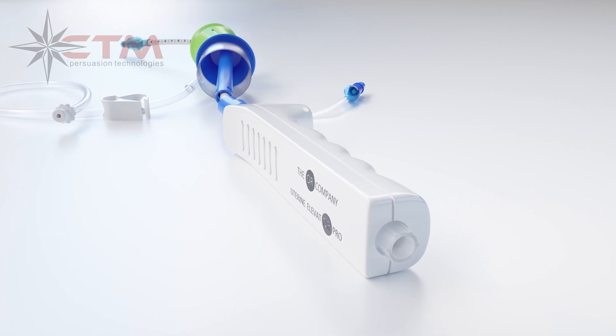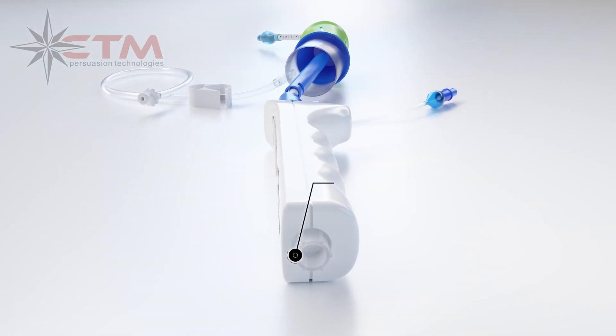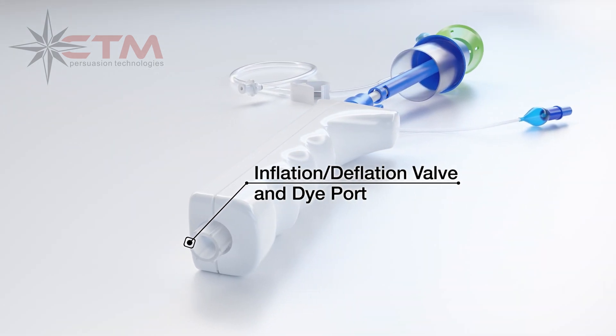A longer, ergonomic handle for a safer and more efficient manipulation capability, with an inflation-deflation valve and a dye port built into the handle.